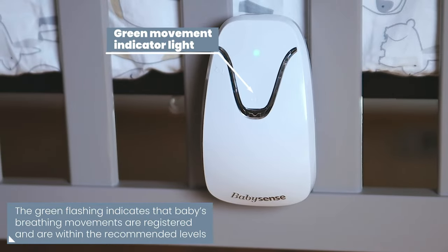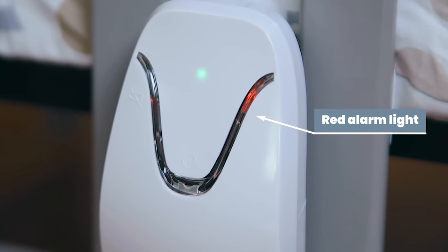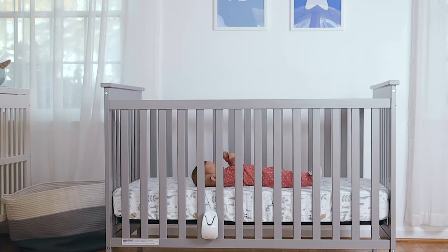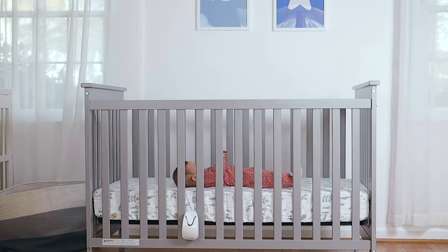If movements stop or drop below the recommended level, an audible and visual alarm will be activated so you can attend to your baby in time. BabySense 7 constantly monitors your baby's breathing movements and alerts you if movements are irregularly slow.